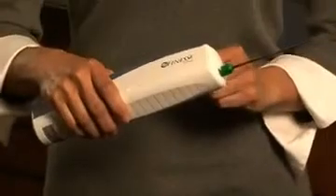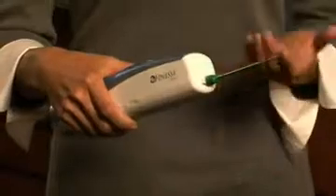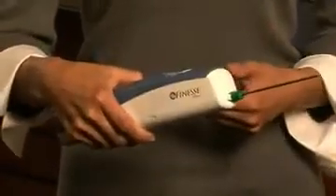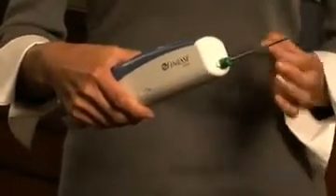Weighing less than a pound and completely self-contained with no external wires or tubing, the Finesse Ultra biopsy system provides important advantages: vacuum assistance for large contiguous samples, lightweight ergonomic design for exceptional handheld control, and SIMS technology — the ability to acquire multiple samples from a single probe insertion.